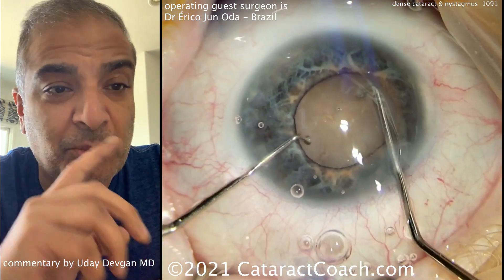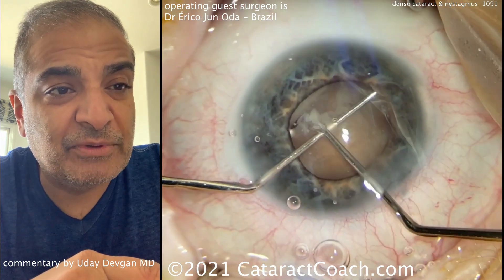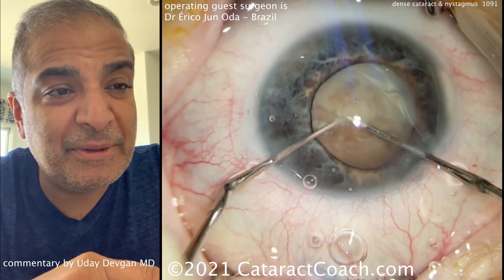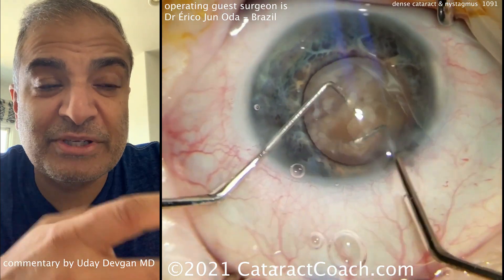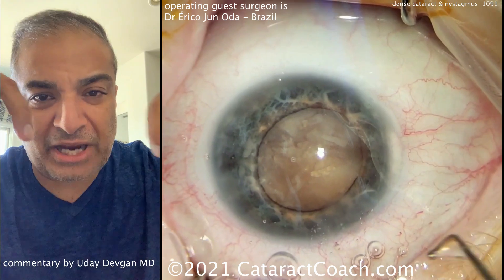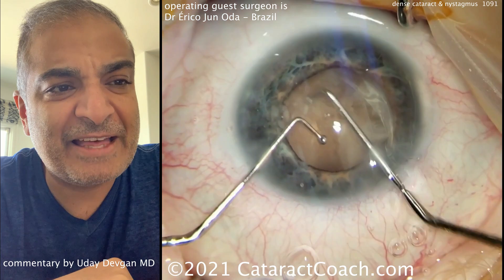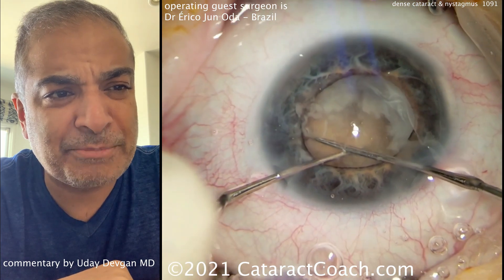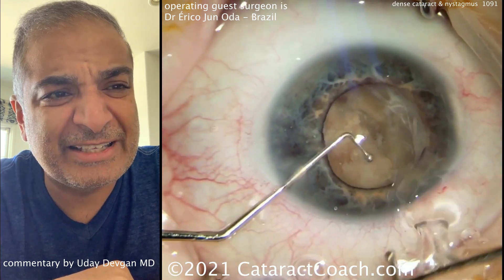Let's watch the technique — this is the first time I'm watching the video, so we're watching it together. Two choppers going inside the eye to rotate it — that's a very helpful maneuver. And now the two choppers are going to the equators and chopping the nucleus just like that. Beautiful separation. The technique of using two choppers 180 degrees opposite each other traps the nucleus between the two chopper tips so you can split it. You don't need holding power because you're lining these exactly opposite each other.